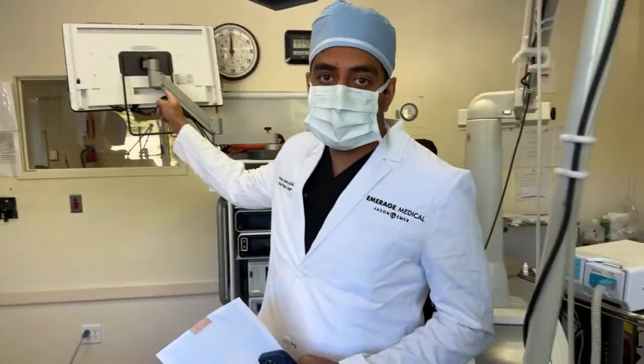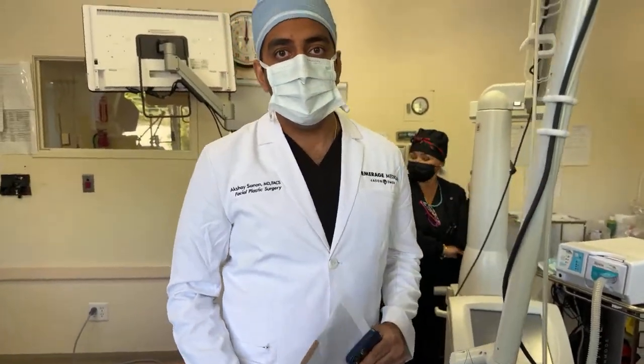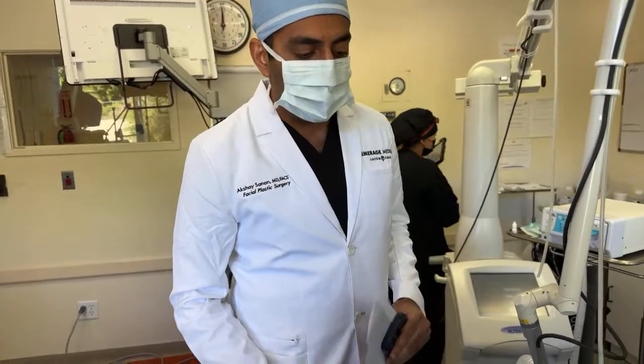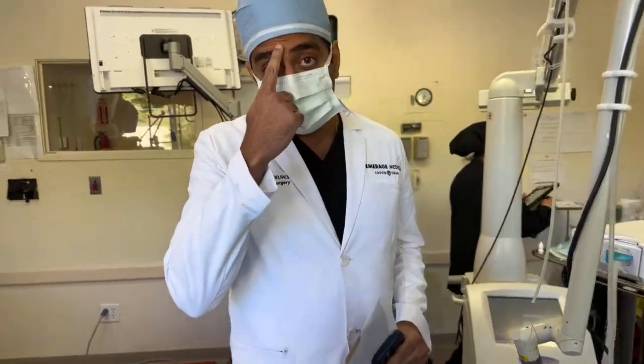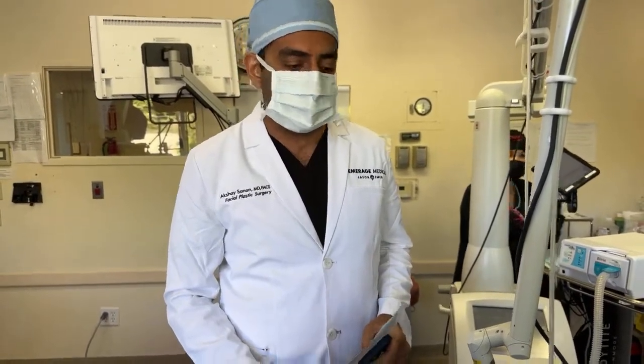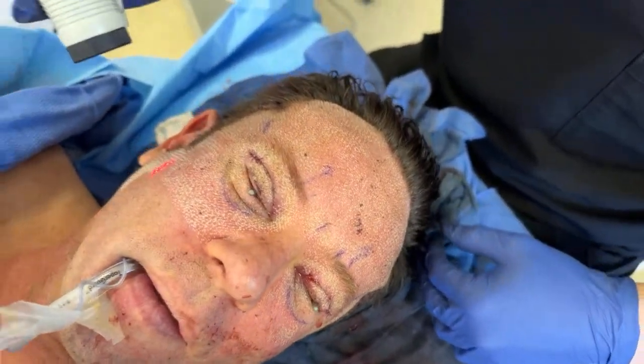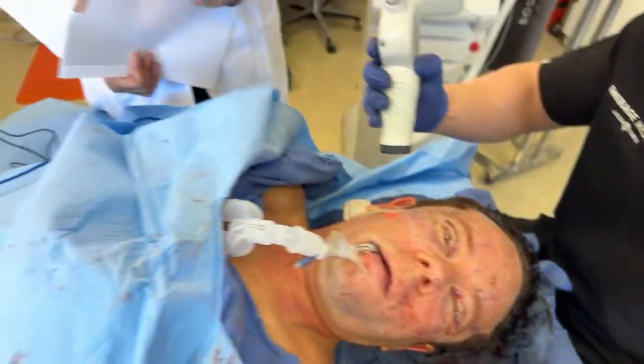We use that big screen behind you. It displays on there. Yeah, so this is the screen that we use. So we have a camera that lets me see the anatomy very clearly, and then I have my dissection tool in my other hand. I'm able to lift your middle brow and the corner brow with an endoscopic brow lift, so it opens up your eyes and makes you look less tired, makes you look natural. That's the key. You're not going to look overpulled and surprised, which is what we want.